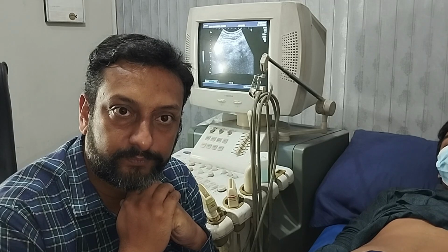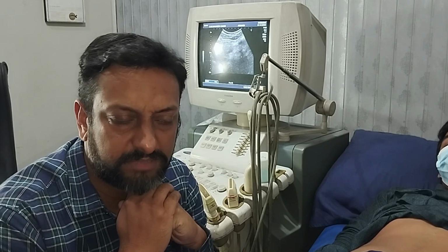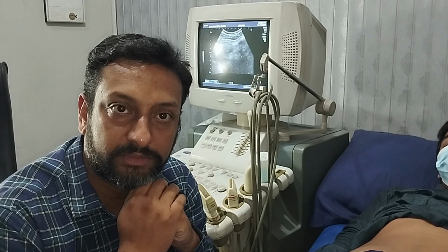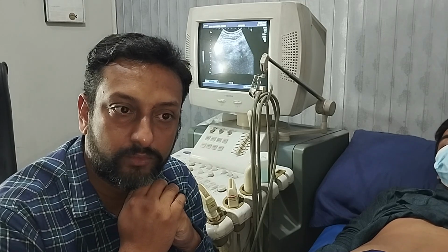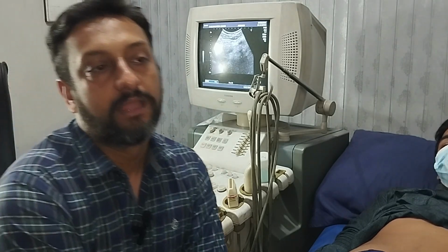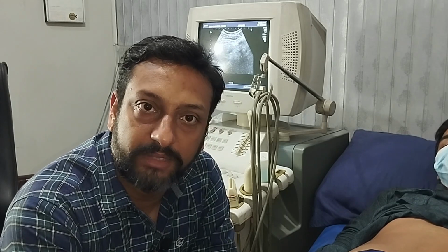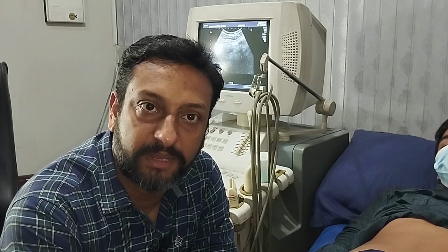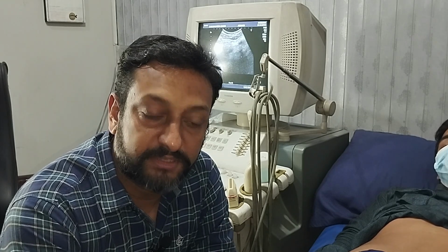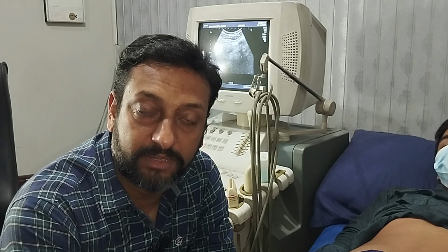Pancreas is a retroperitoneal structure. That's why it's a bit difficult to visualize it. Anyhow, continuous practice could make you quite able to visualize the pancreas. And from time to time, it is possible that in some patients you might not be able to visualize the pancreas despite all your efforts. Especially when the patient is overweight, it will become very difficult.